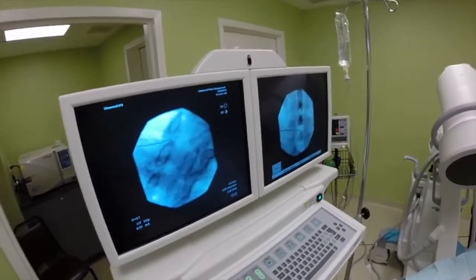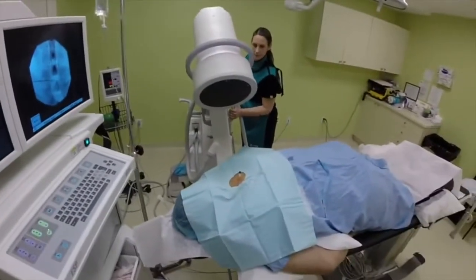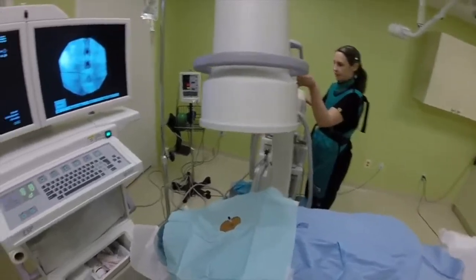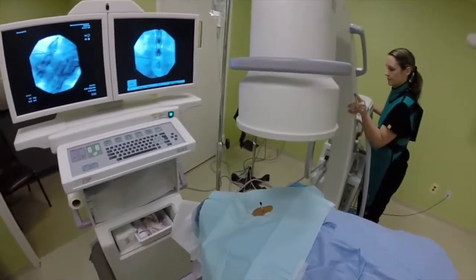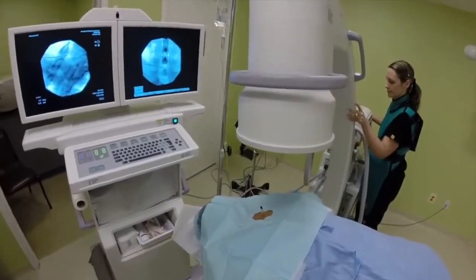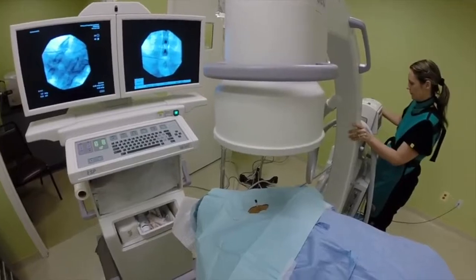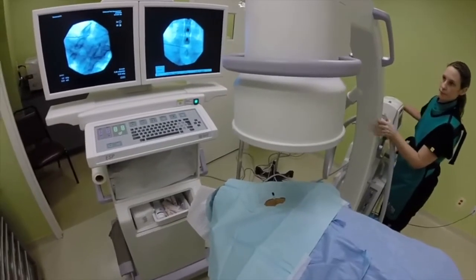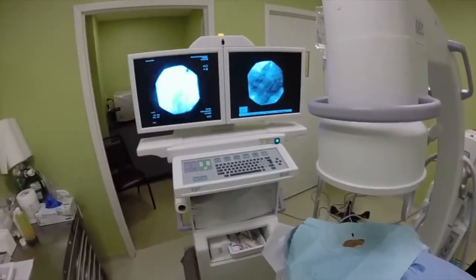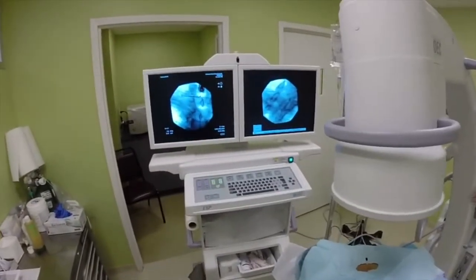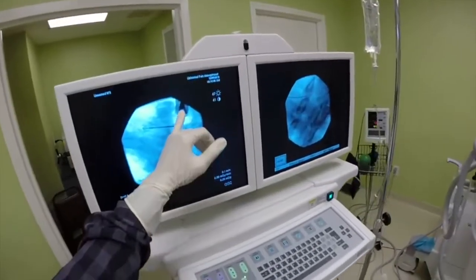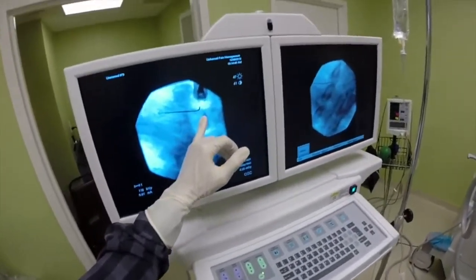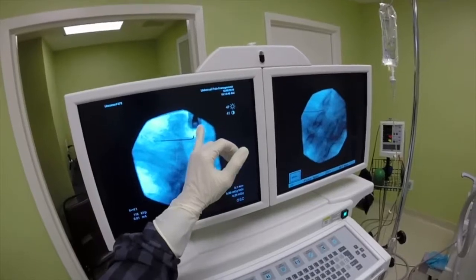Let's go back to AP. The reason why we are going back to AP is we want to see how far the needle tip is from the midline, and whether it is still on the side of needle placement. My needle is on the side of the needle placement and it is close to midline.